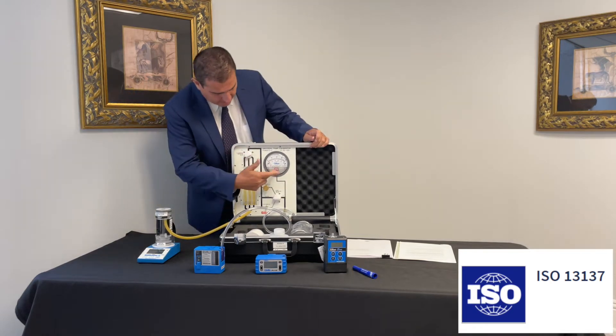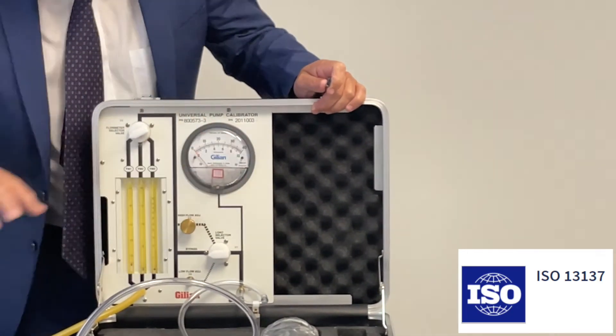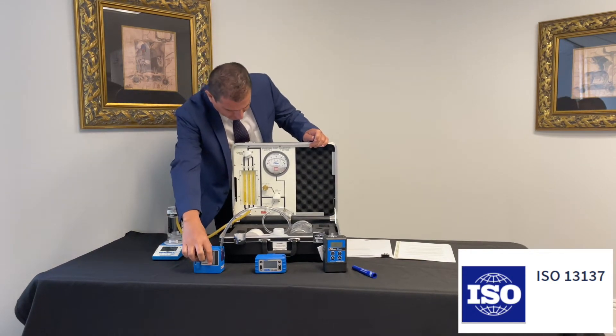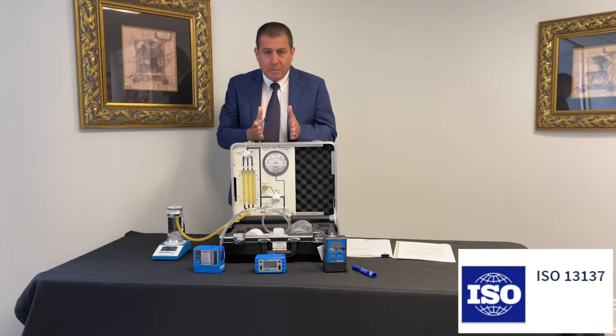Here we have a calibration system, a system with flow meters, a manometer gauge, and a primary flow calibrator. What we're going to do today is simulate back pressure. According to ISO 13137, there are certain important requirements.